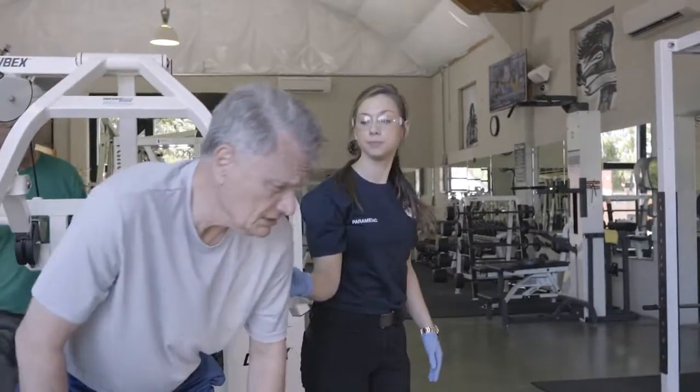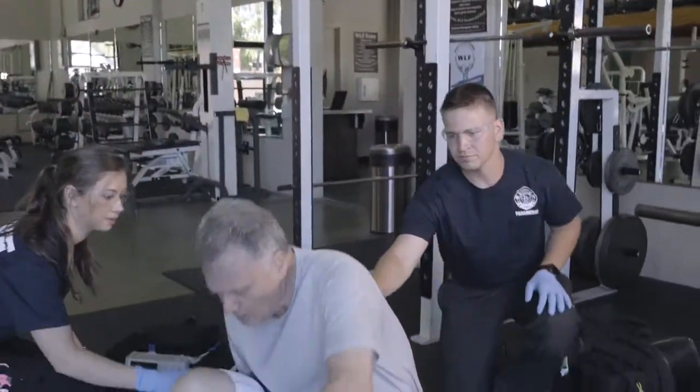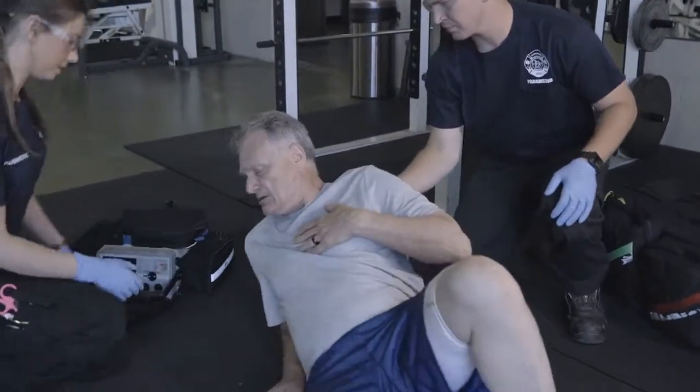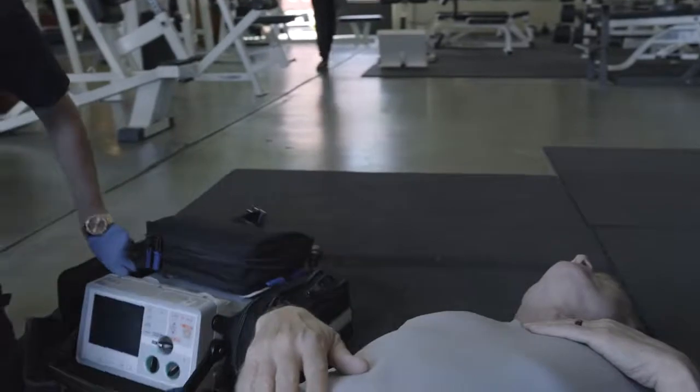Today, EMTs must be able to place a 12-lead ECG, and paramedics should be prepared to interpret the reading to make a determination on a patient's condition, appropriate transport, and treatment.